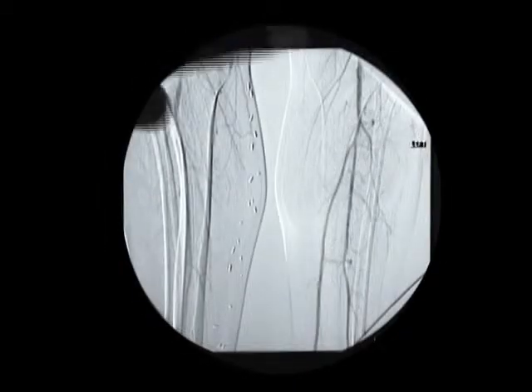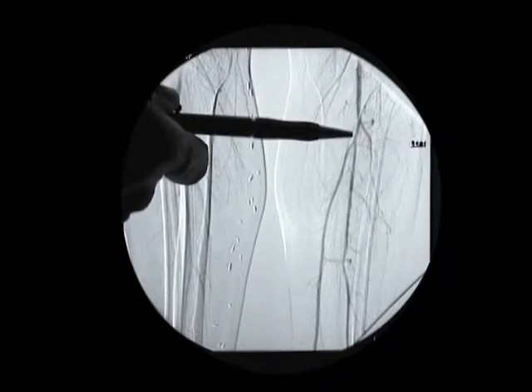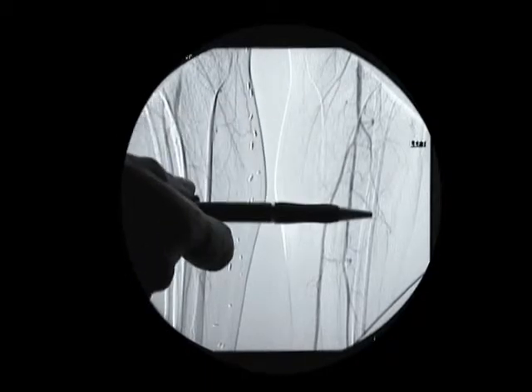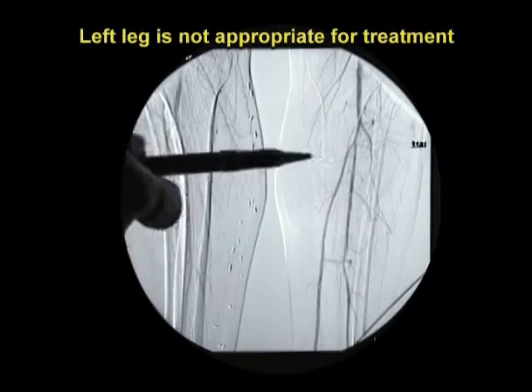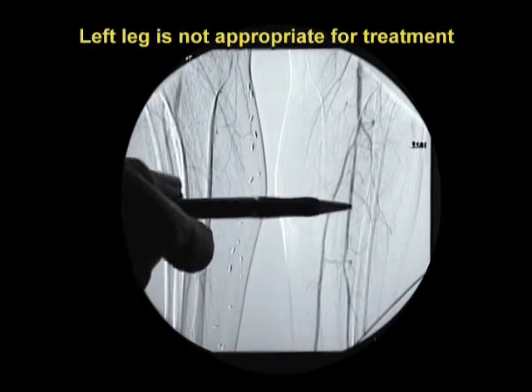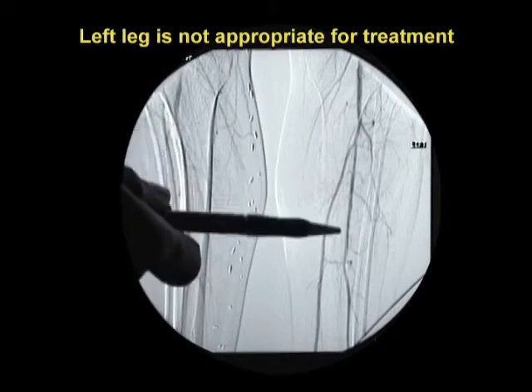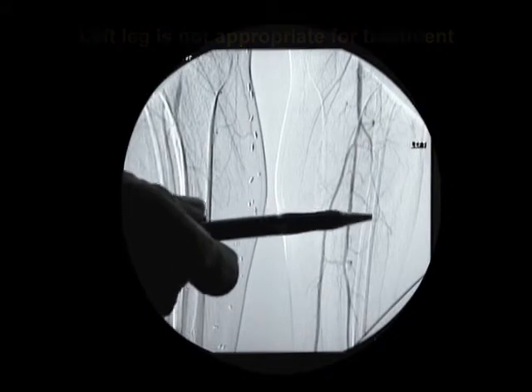On the left side, we see the below knee popliteal artery is of quite good quality. The tibial peroneal trunk is patent, and there is nice two-vessel runoff through the peroneal and posterior tibial artery. The anterior tibial artery, however, occludes. The anatomy seen on this left side would not typically be appropriate for inclusion in this trial, as a femoral to below knee popliteal bypass would be a standard revascularization option.